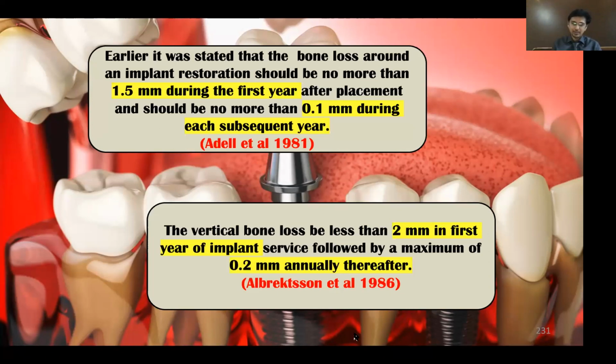Are you getting my point? But the point is, I hope my voice is not breaking. What was the implant connection? Okay, implant connection in that study was internal hex only, both with regard to slim abutments, that is platform switched, as well as with regard to the normal, that is platform matched, it was internal hex. Internal hex only. Morse taper also we used, but in that case we had used internal hex. That's fine, Fatima.